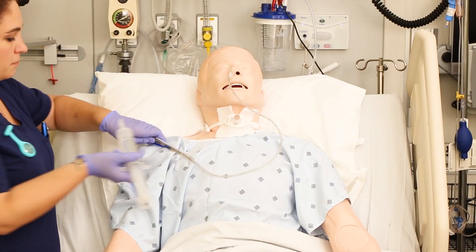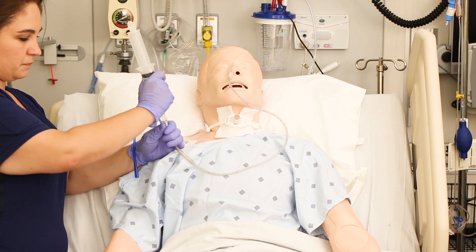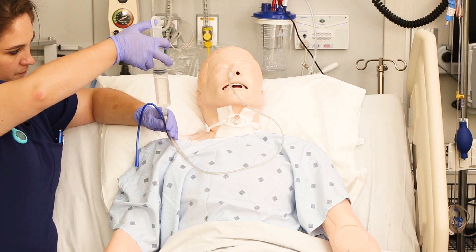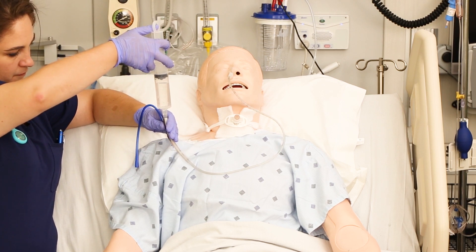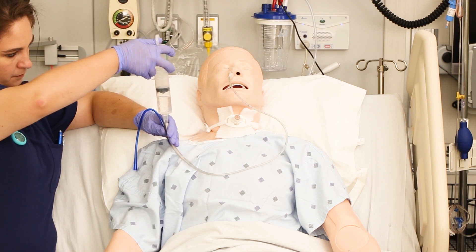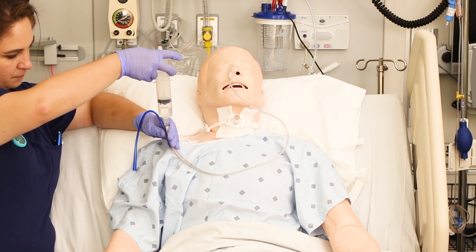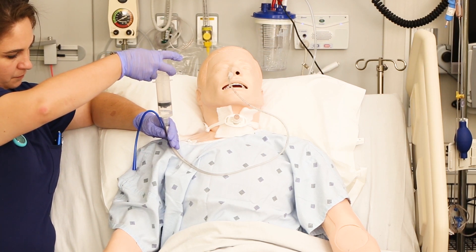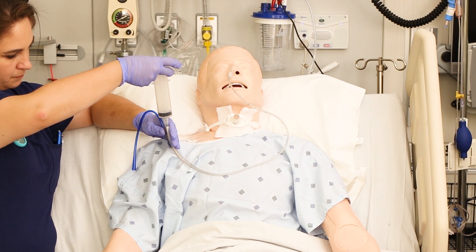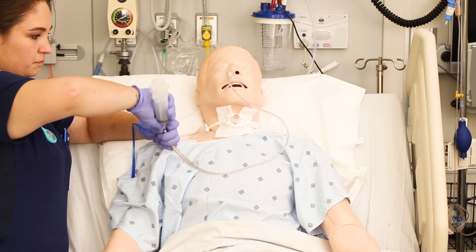We're going to flush these NG tubes with 30 to 60 mils of water every four to eight hours, depending on your orders, or before and after we use it — this keeps it nice and patent. Use a 60 mil catheter-type syringe and fill it with tap water. Remember, the gut's not sterile, so tap water is totally fine. Attach the syringe to the NG tube and flush gently — it should flush easily and without any resistance. Avoid super cold water because that can cause really bad stomach cramping; room temperature tap water is just fine.